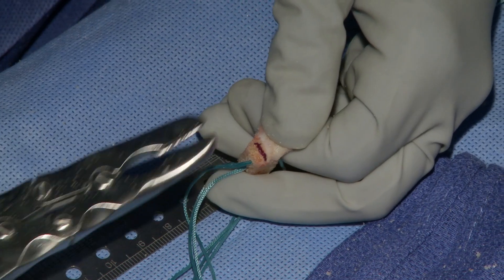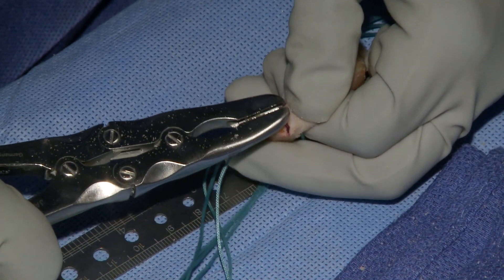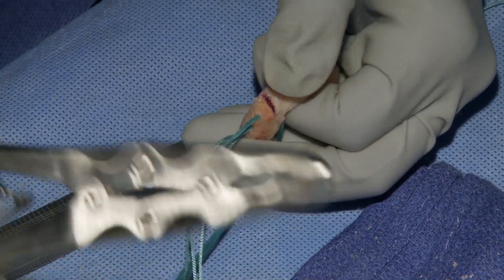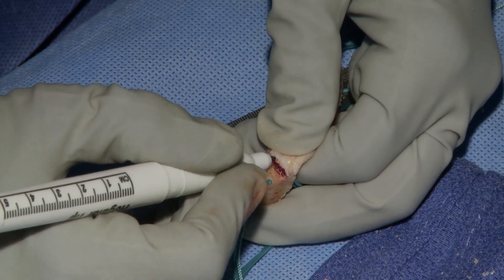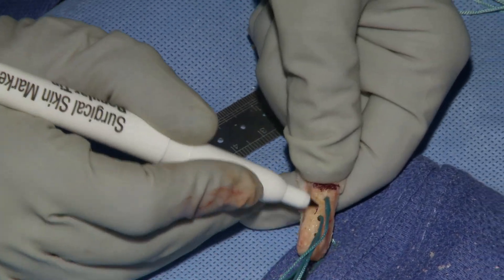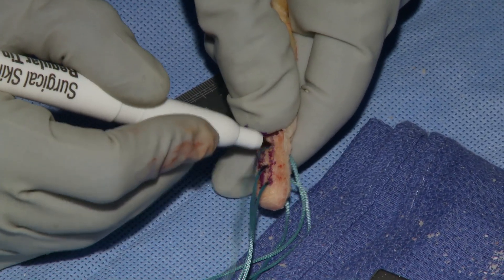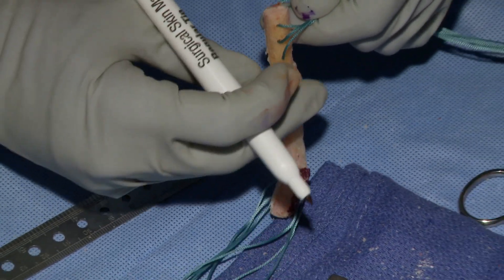Then I measure it and mark it. Once the graft fits perfectly into the 10mm tunnels, use a marking pen to mark that little area of step-off so that the surgeon can see it when the graft is intra-articular. I also mark where the sutures are on the bone to help with orientation when it's inside the knee, because everything looks the same color.